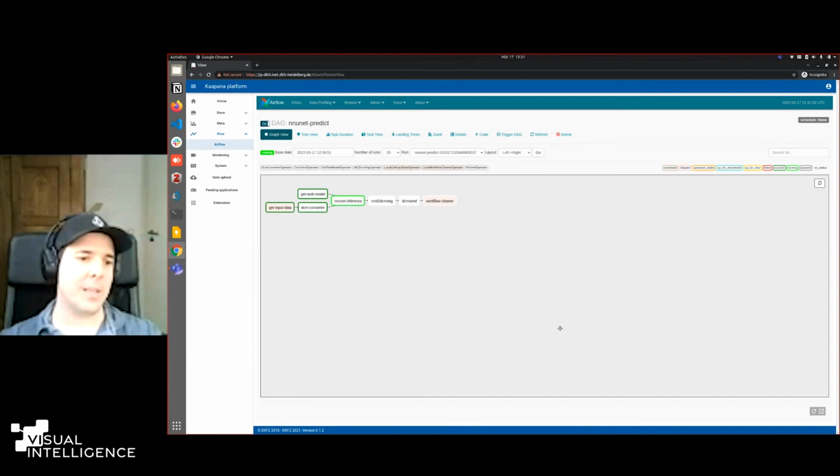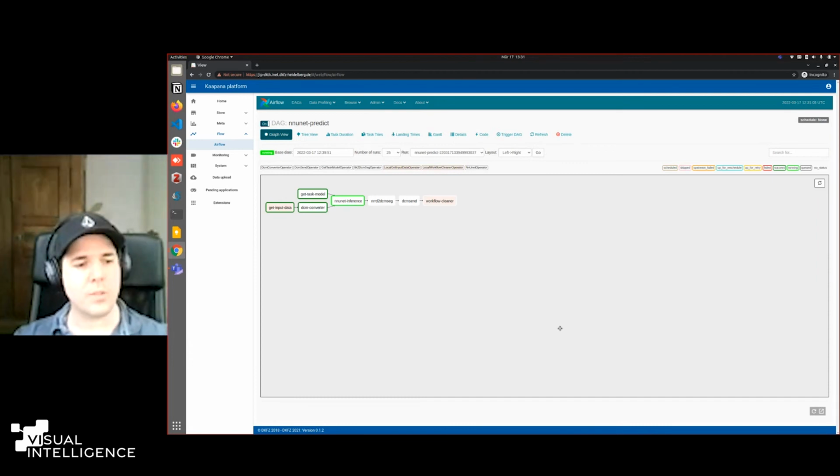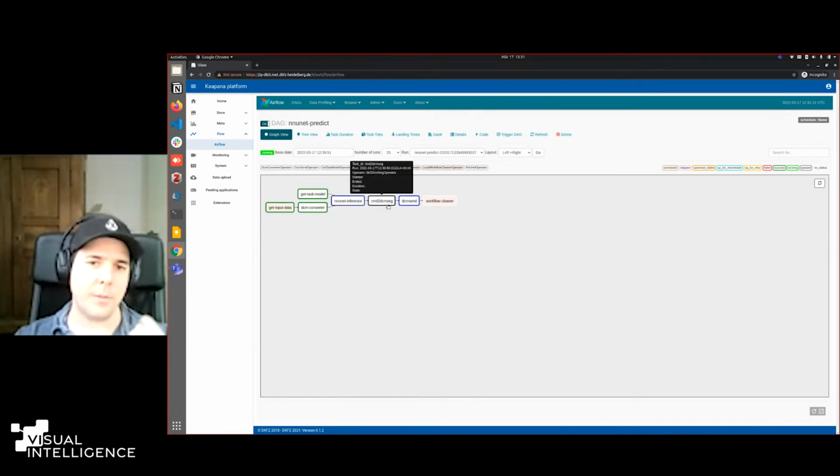And as I said, we don't want to have NIfTI. We want to stay in DICOM because we want to have the standardized outcomes. So we will take this NIfTI from the nnU-Net inference, put it back into a DICOM segmentation object, and send this back into our main research PACS, where it will pop up just as a segmentation. And we can also have a look at that.